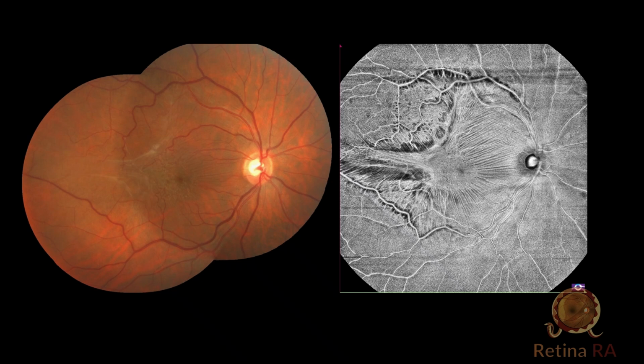As seen in the color fundus photograph, there was significant tangential macular traction, particularly at the temporal side. And face OCT demonstrated this remarkably well. It clearly showed the contraction of the epiretinal membrane, distortion of the retina, and traction-related retinal damage. B-scan OCT shows us the loss of foveal depression due to ERM.